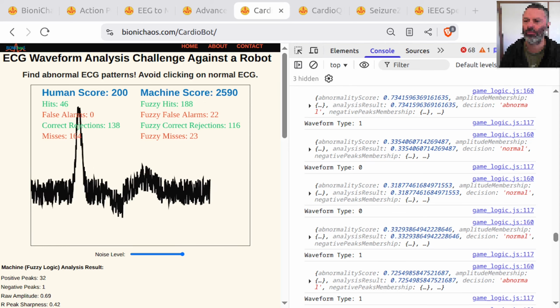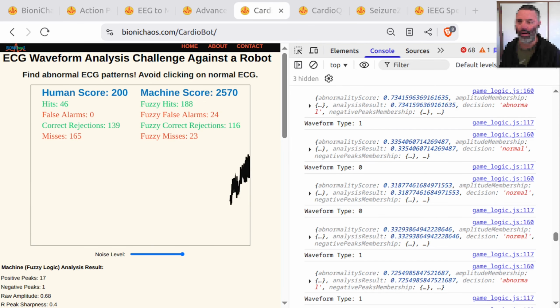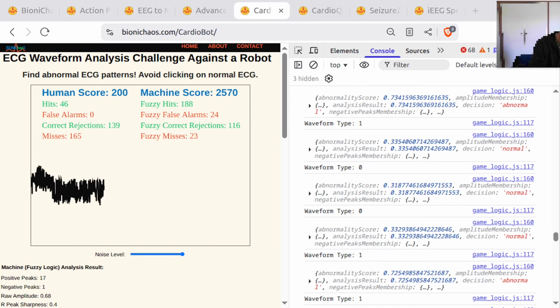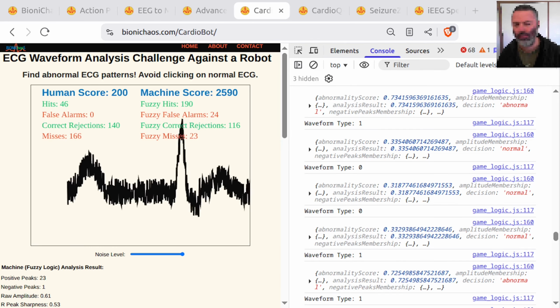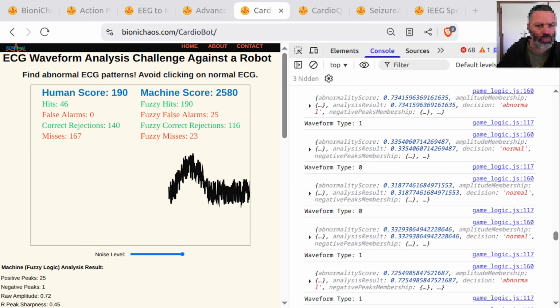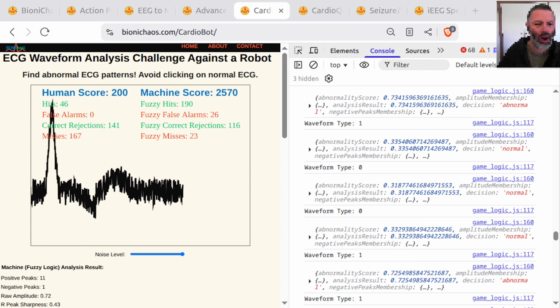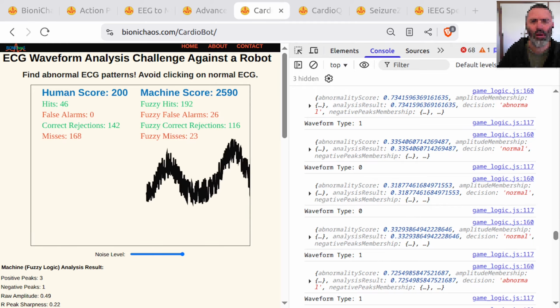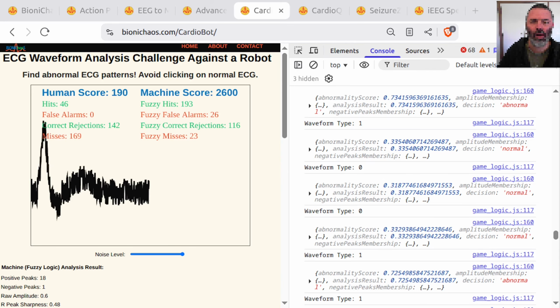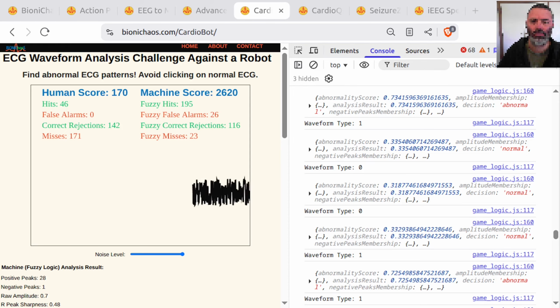Why is that so hard for JavaScript? Because scipy is a highly optimized library. It's written in performant languages like C and Fortran. When you use find peaks to identify the QRS complexes and the negative peaks with that calculated prominence value, it is incredibly fast and robust. To do that in vanilla JavaScript, you'd have to write your own specialized, highly tested algorithm for peak detection, and it would likely be significantly slower, especially on older devices or for longer ECG strips.